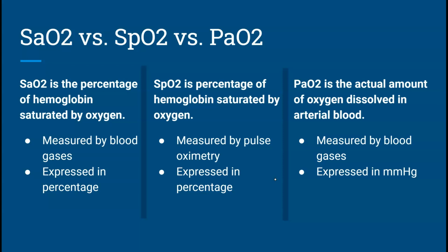They very commonly do it on the elderly, especially in the hospital. If you have a patient with really bad edema, full body edema, and they can't get a good reading on the fingers because of the edema, they'll put it on the forehead because you don't really get an edematous forehead very often.